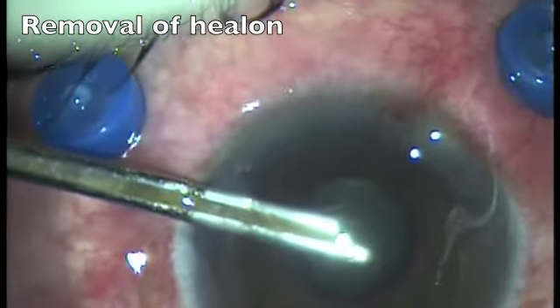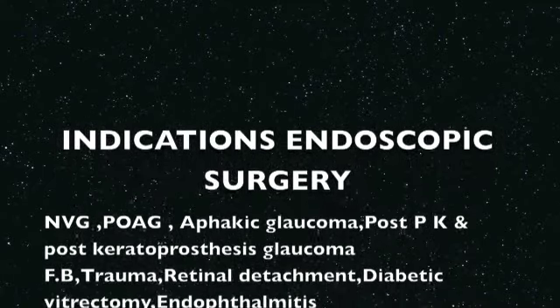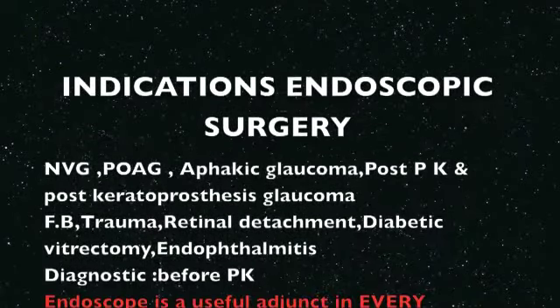Healon is being removed at the end. Endoscopic cyclophotocoagulation is an effective and safe procedure for refractory as well as routine glaucoma. The endoscope is a useful adjunct in every vitreous surgery.